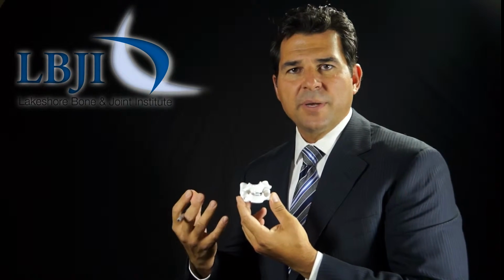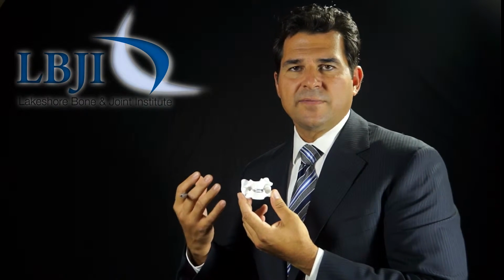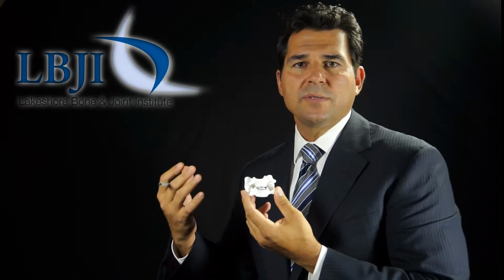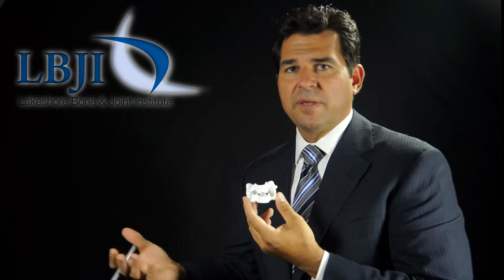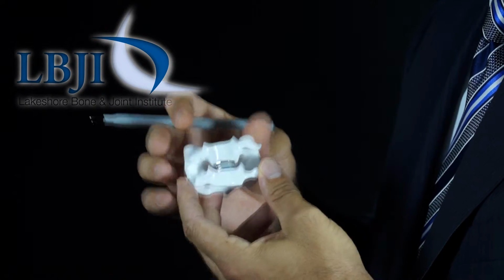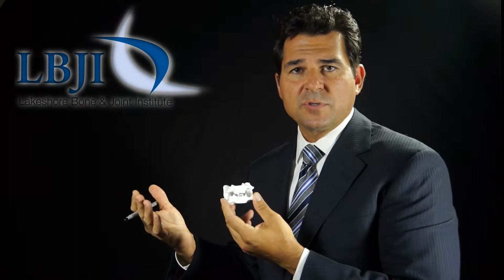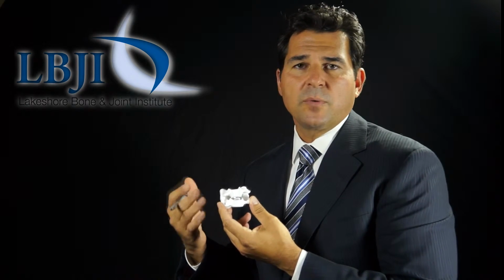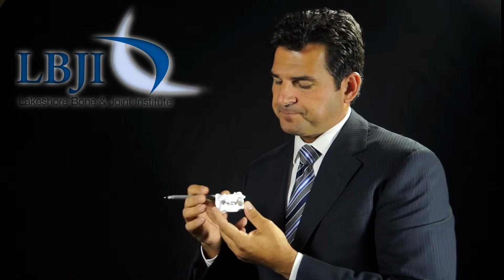The problem with having a patient immobilized while that fusion heals is it tends to make their neck quite stiff, and then we're going to have physical therapy required to regain that motion and also overcome that stiffness that has occurred secondary to immobilizing the neck while we're waiting for that fusion to heal. In contrast with the fusion, an artificial disc allows patients to start moving right away after surgery, and typically we have them driving within a week or 2 after surgery once any discomfort has settled down.